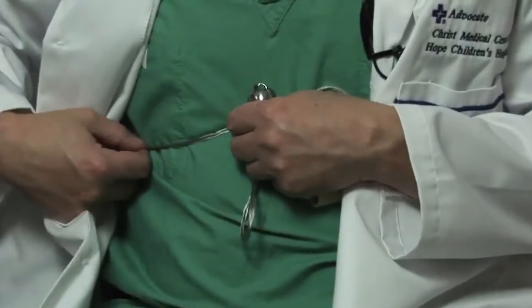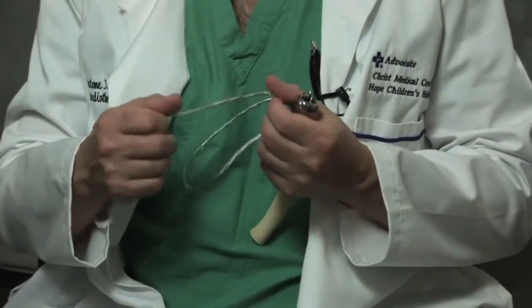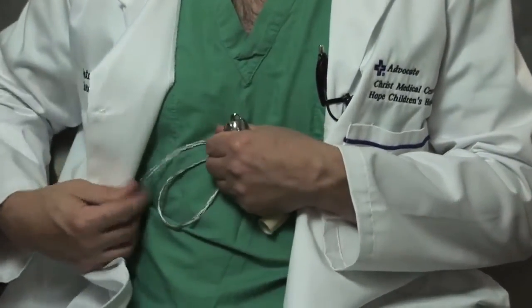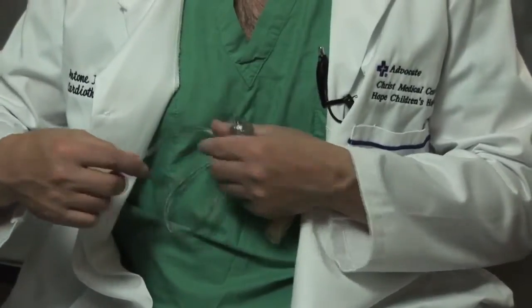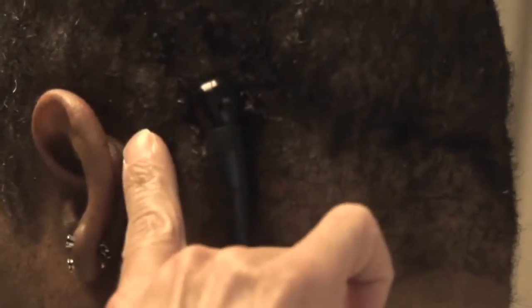To power this pump, the electrical cable has to be plugged in — it's plugged into batteries. In most people, in previous generations of pumps, this electrical cable came out through the abdomen or through the side of the chest. What we have seen in many of those patients is that they can develop a propensity for infection where the electrical cable exits the body.